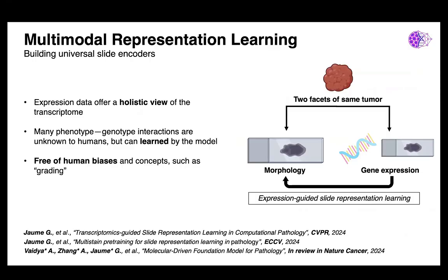So in the previous study, we showed that we're contrasting the text of a generated or what exists in the pathology report. The reason we needed to generate text, by the way, is because the pathology reports are often very sparse. They don't have really detailed, dense morphological descriptions, and any description there might also not have a very deep relationship with the image itself, because it's often written at the level of the case and not at the level of the individual image. So we're contrasting with text, which is subjective, but there's lots of other data that's available in pathology that can be more objective, like immunohistochemistry, understanding special stains that exist, as well as transcriptomic genomic information that exists. So that's what we started to do.